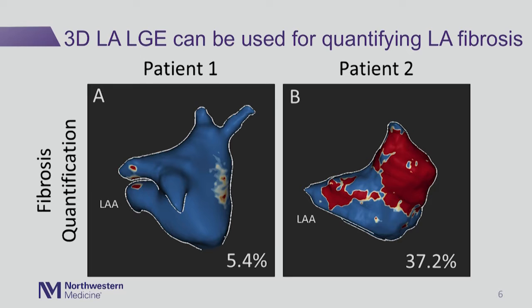And finally, here are just some examples of our imaging that can be used to quantify LA fibrosis, and our values are comparable to what is seen in the literature.